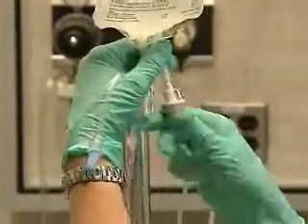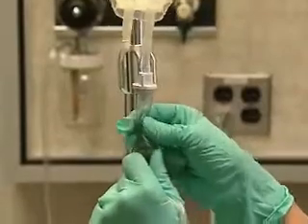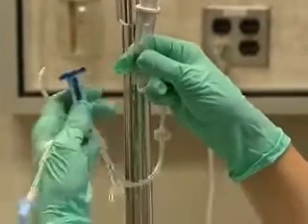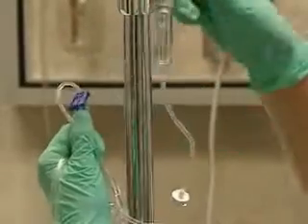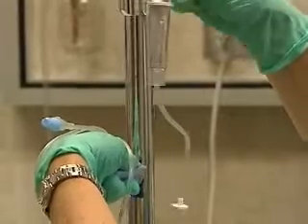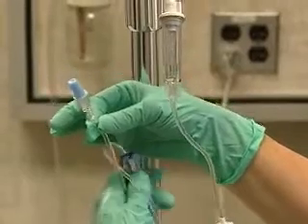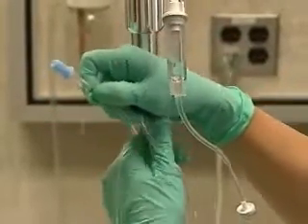With the tubing occluded in the roller clamp, squeeze till this chamber is half full. Then, unroll the roller clamp, making sure to protect the distal end of the tubing and to keep it lower than the chamber. Flush the tubing, vibrating the line gently to drive bubbles along the line and safely out.